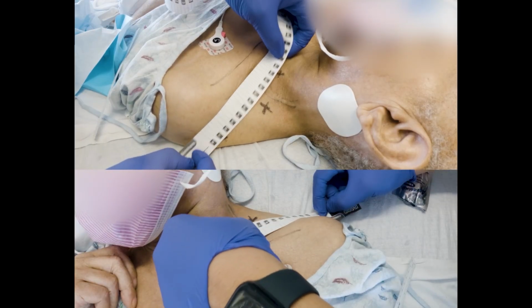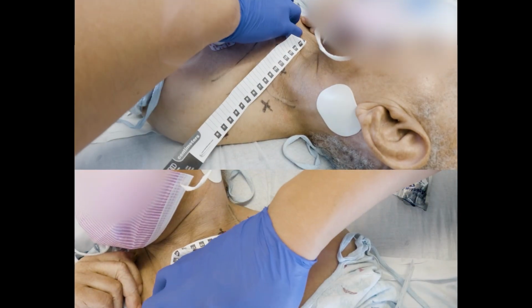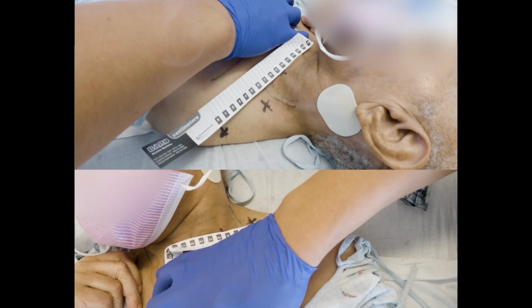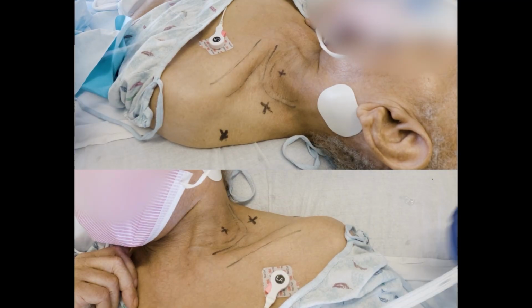So from here to here, let's add 11 because of the turn. It's still about 20, 1, 2, 3. So we have about 29, let's say 33. Yeah, let's go with a measurement of 33. So we commit to that, and then let's get prepped and started.